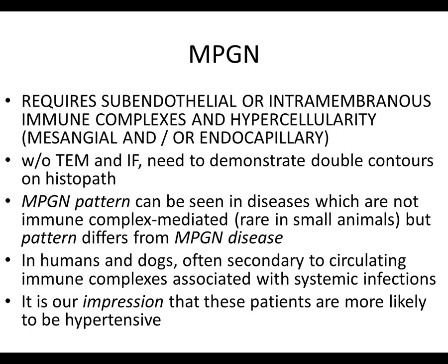That is addressed in the hopefully soon to be published Jubb and Kennedy chapter, and Dr. Moore and I definitely addressed that topic of the difference between a pattern and having membranoproliferative glomerulonephritis. So if you have questions about that, that would be in the future as opposed to actually having to know it from the 2014 boards. If you're taking boards this September, then just forget everything I just said.